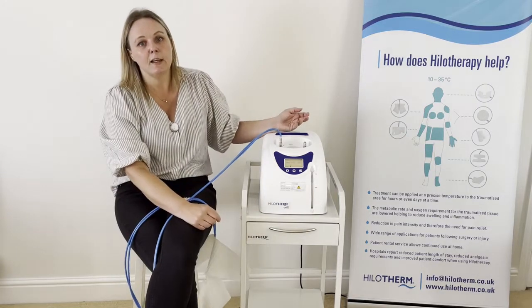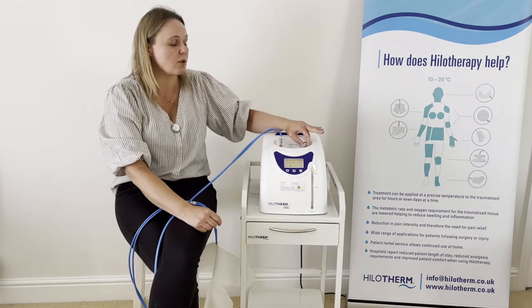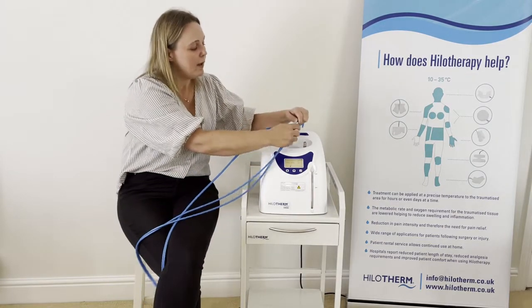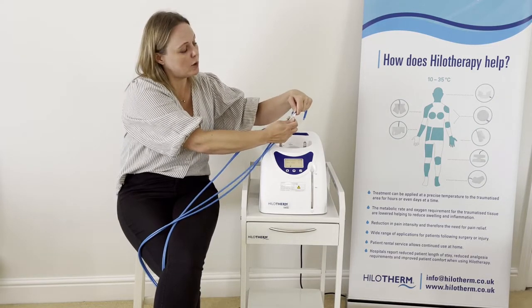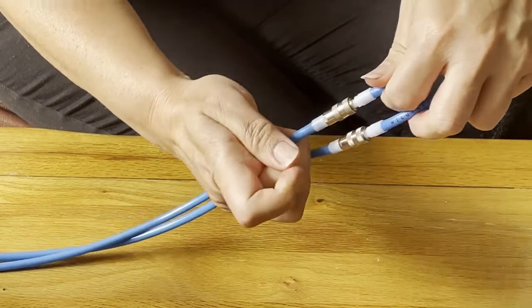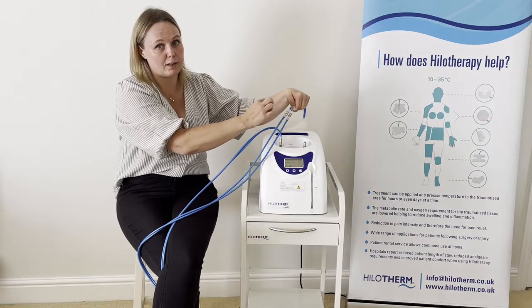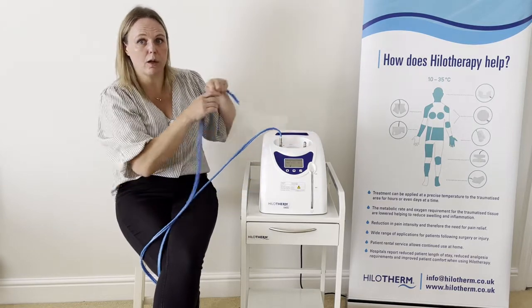Over time the connectors can start to stick, so if that is happening you can use either Vaseline or WD-40 to lubricate those points and keep them free moving. The connectors on the end of the long blue tubing work the same way — pull down and place on. If you don't have a cuff connected, make sure they are down away from the end of the tubing rather than popped up, otherwise water will come out.